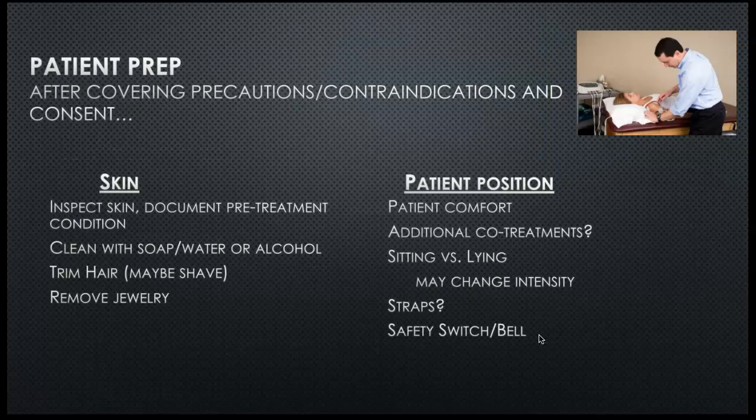All right, preparing your patient. You always have to cover this in your own head and also by talking to them. You have to ask them some questions to make sure there are no precautions or contraindications, right? Then you gain consent: is it okay if I use this on you? And you need to tell them why you think it's going to be good for them and what they should expect. Then you're going to look at their skin.